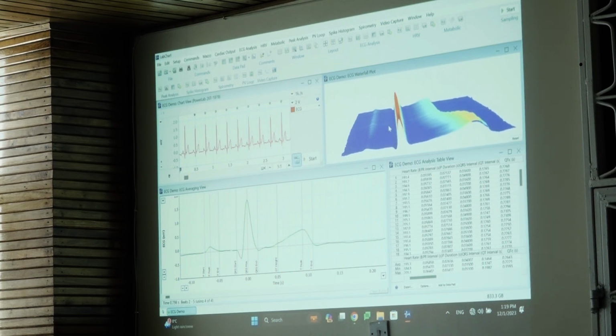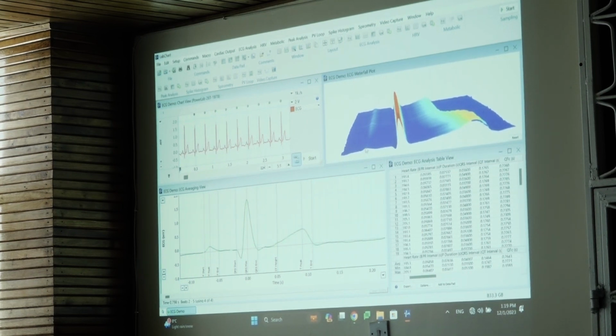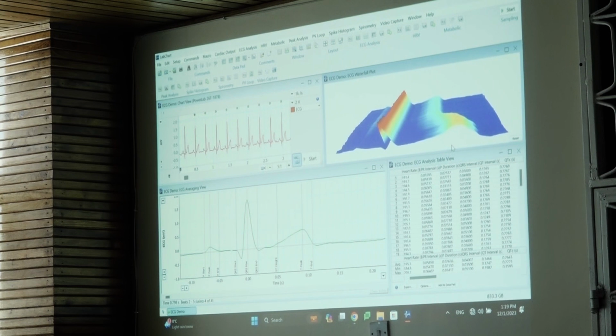You can see on the left hand side, almost can't see much, that's a P wave, that's a QRS here, this one. And the interesting point here is probably during this experiment, either they gave a drug to the rabbit or they exposed him to something else or whatever, and then recorded over time. And you can see here now over time how the T wave shifts, so the QT interval increases. So that's also a way to, over time, look at how it changes, not just a start point and an end point, but also plotted over time in a very nice visual way.